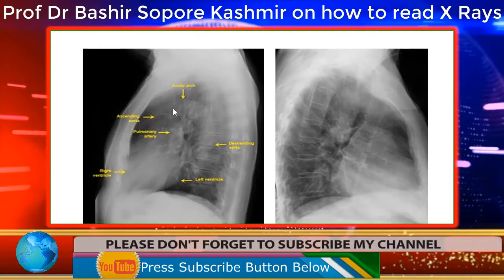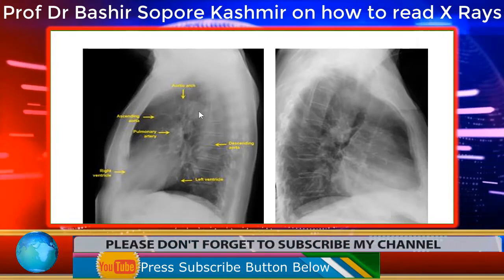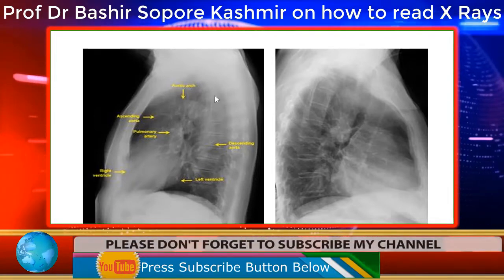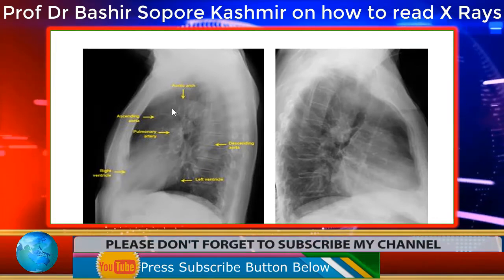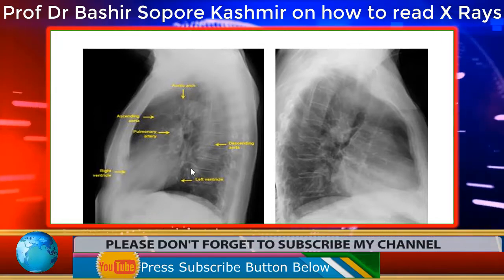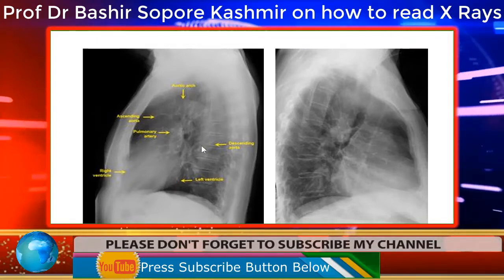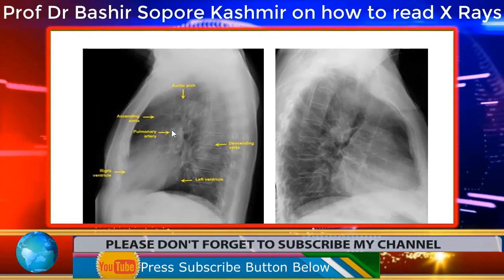And if you see this shadow also from here goes like this, it arches and then goes downwards. You can see this is the shadow which is in front of the spine, and this shadow is arch of aorta and this is descending aorta. That is how we see the shadow of the heart on the lateral view. And here this is the pulmonary artery.